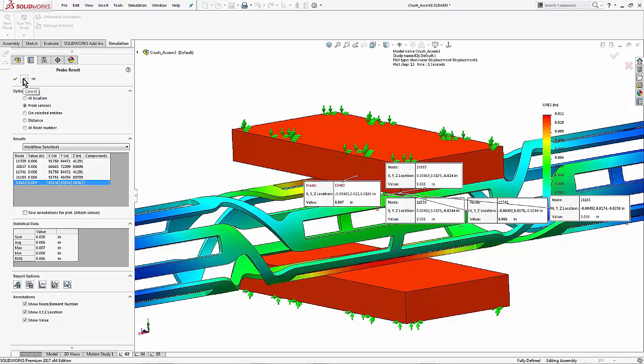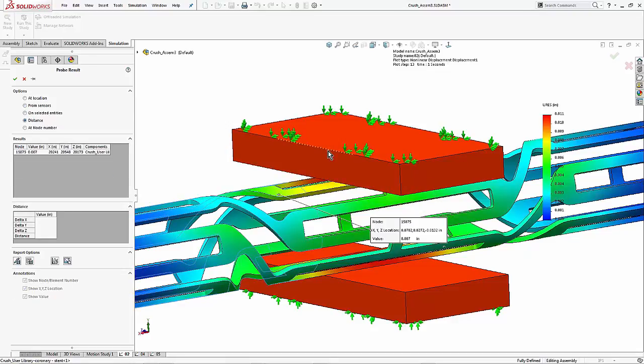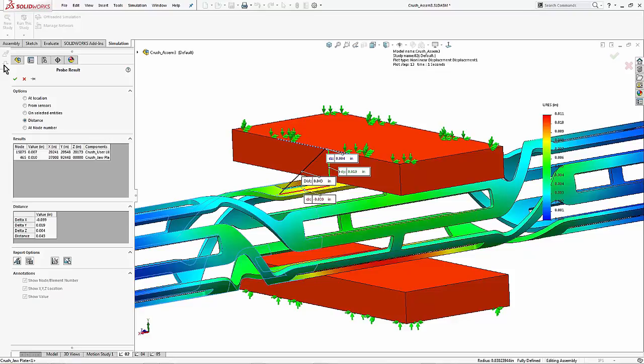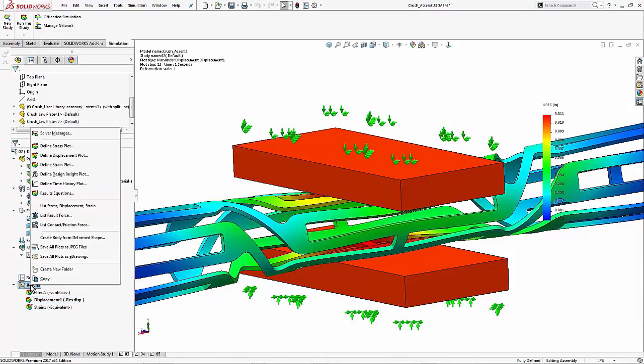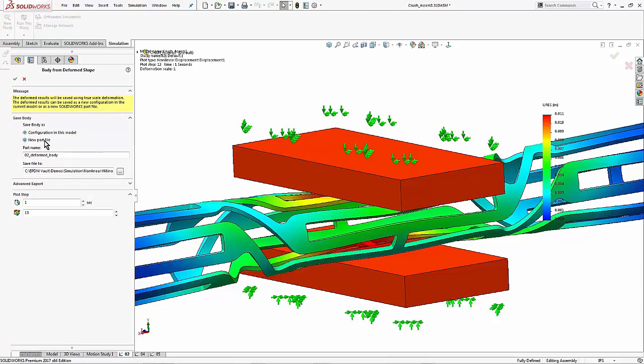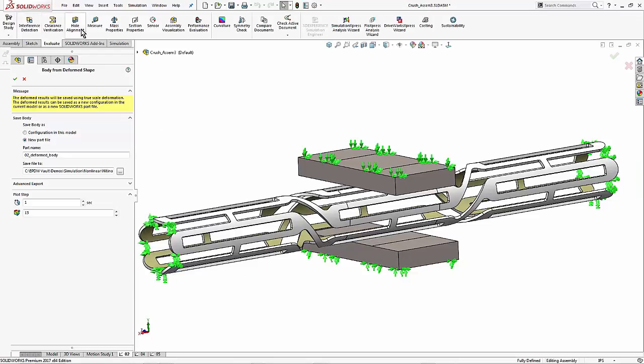The third thing I wanted to talk about was deformed bodies and getting the displacement of those. First up, if you have any level of simulation, in a displacement plot you can use distance in probe to measure between two points. You'll get XYZ of those two points. Or, if you have at least SOLIDWORKS Simulation Professional or higher, you can right click on the results folder and save this body as a deformed shape. This new body can be imported into your assemblies to check for interference or just to do your own displacement calculations using the SOLIDWORKS's evaluate measure tool.